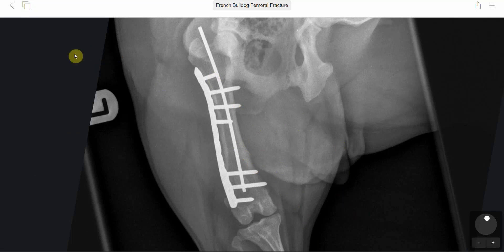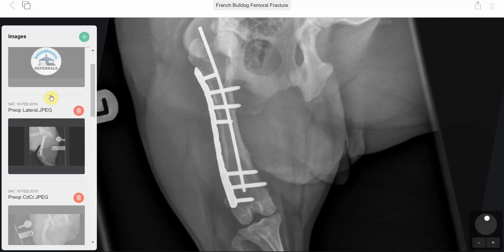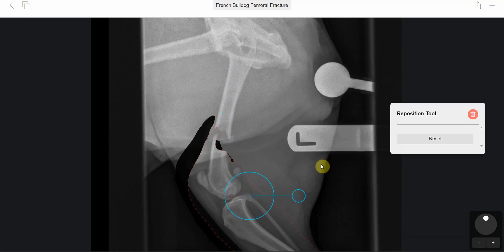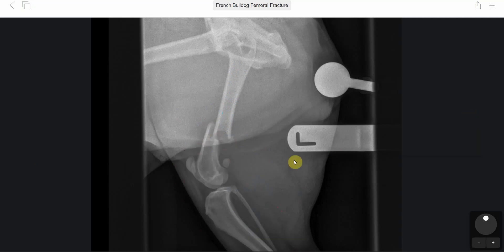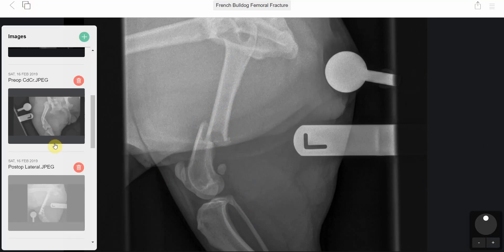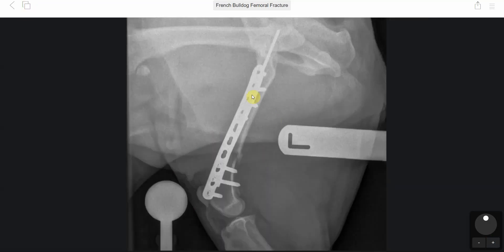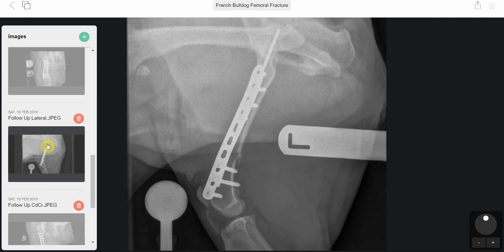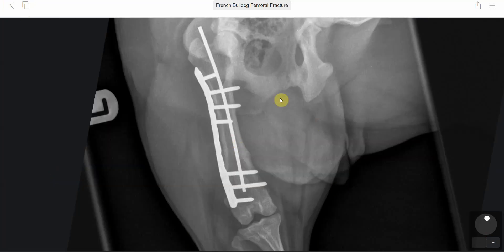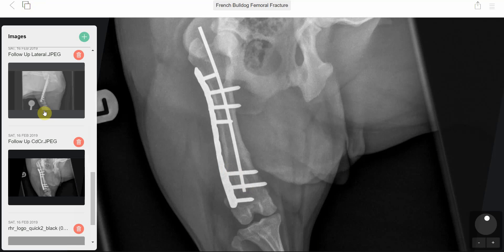All around we were really pleased with this, and there was minimal lameness. The lesson here is that even if the fracture looks simple at first, trying to reduce it would have been the wrong approach, because the fragment made that ineffective. Using the plate-rod combination enabled good fracture healing, no implant loosening, good spatial alignment, and the patella can be seen sitting nicely in position.